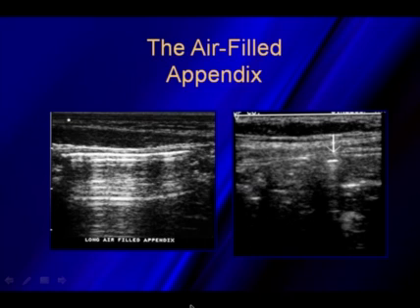If this were small bowel, when you rotated your transducer 90 degrees, both views would look like this with the ring down. What I have seen is, in using compression, sometimes being able to move that gas back and forth, and that's why sometimes you may hear people say that they have seen peristalsis within the appendix, but it's just the normal gas within there.